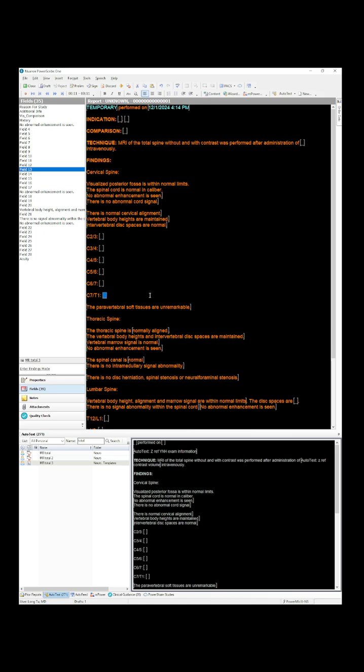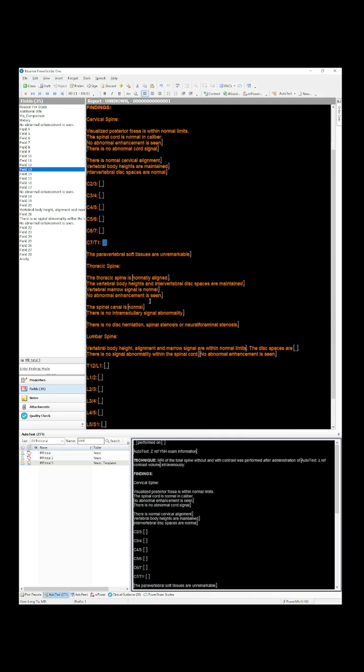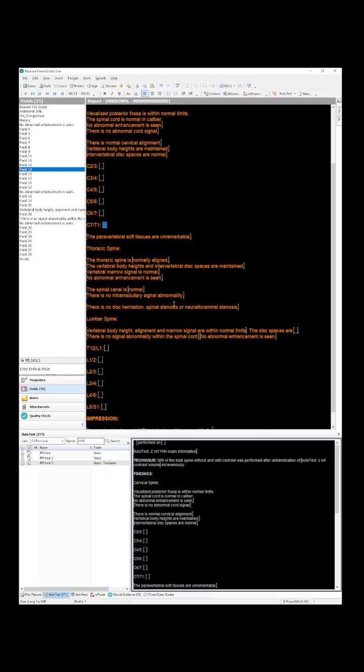A lot of times we're doing these on patients with really advanced, diffuse metastatic disease, or bad metastatic disease or bad infection superimposed on a lot of chronic degenerative change and multi-level spinal stenosis, and there's a lot of wording spent on the minor, mild spinal stenosis here, neural foramen at that level or this level, that's often not well seen. It doesn't impact management.